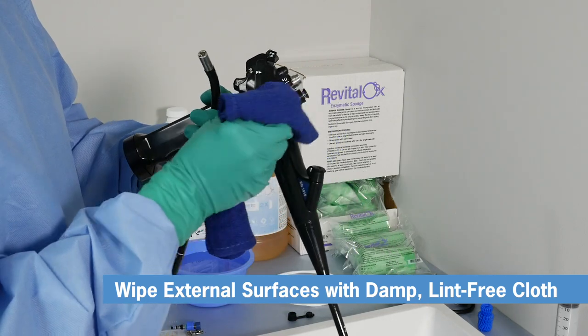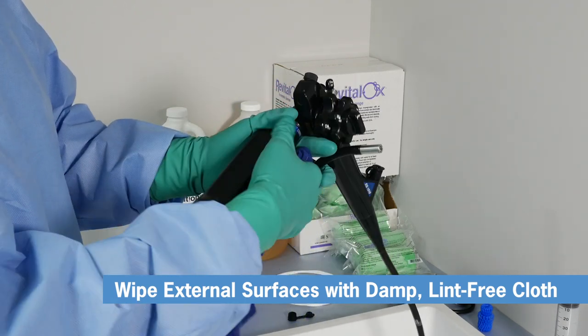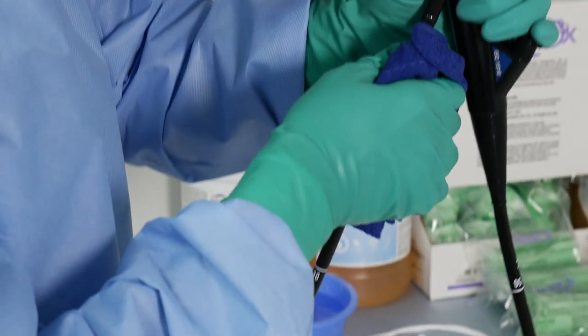Take a damp, lint-free cloth and wipe the external surfaces on the control body and the electronics module. Now wipe the working portion of the endoscope from the boot to the distal tip.